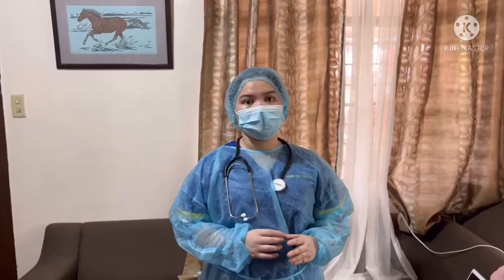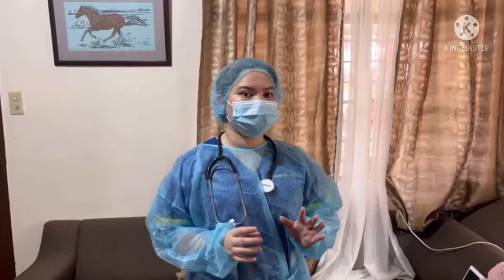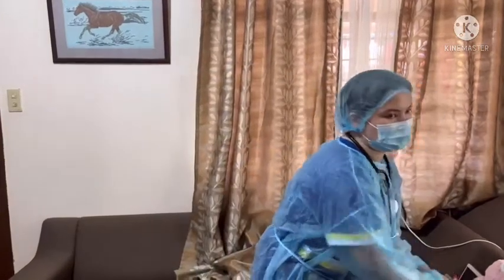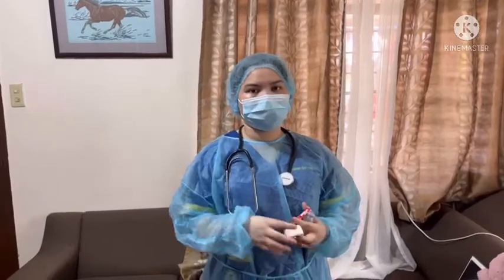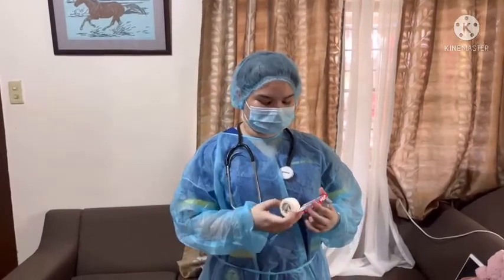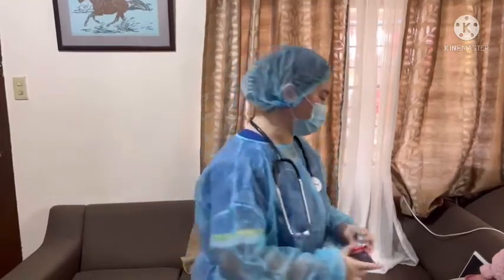Now I'm going to do the procedure, which is checking the CTT, the chest tube thoracostomy. Before doing the procedure, make sure that you have gathered all your supplies: the stethoscope for assessing the lungs, the micropore, the gauze, and the normal saline.